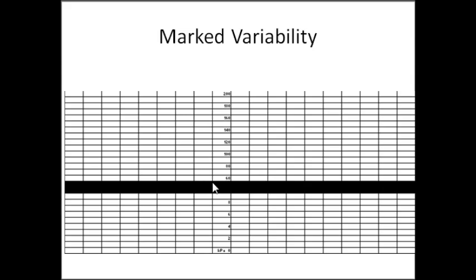And then lastly, marked variability is going to be 25 or more beats per minute. Now this is a little concerning because it would demonstrate kind of like this, where these changes are not just decelerations and accelerations. These are actually the baseline changing.